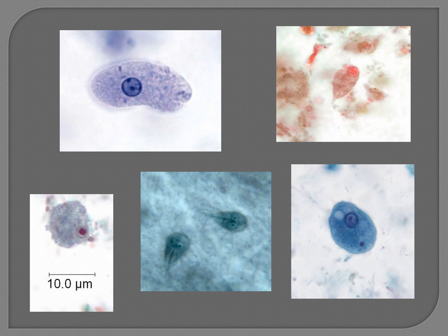Here's a number of trophs on the trichrome stain that I want you to see. The trichrome stain is really nice because we can observe these protozoans on oil. So the upper left, this is a picture of Entamoeba histolytica, and you can tell it's a histolytica because of the fine, even peripheral chromatin. The cytoplasm is kind of lacy looking or frothy looking. And then we have the motility where the organism is actually stretched out and directional. That is pretty typical of Entamoeba histolytica.